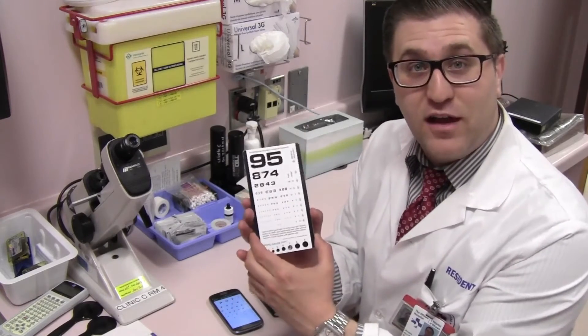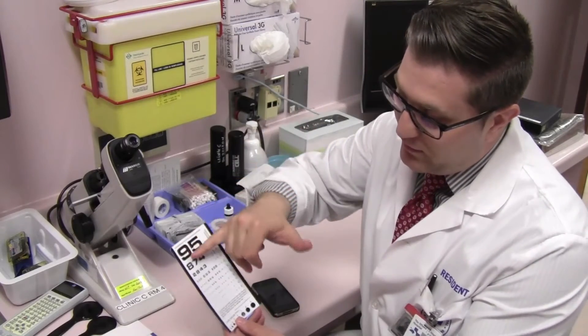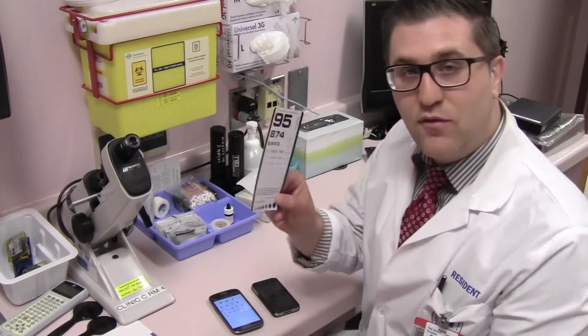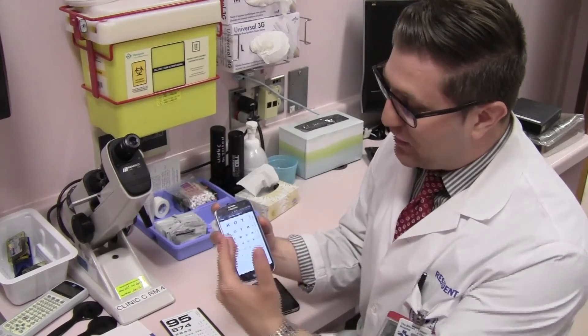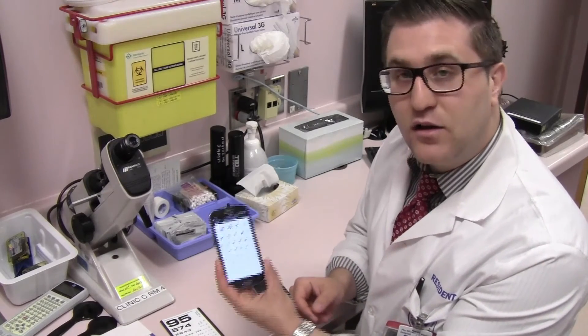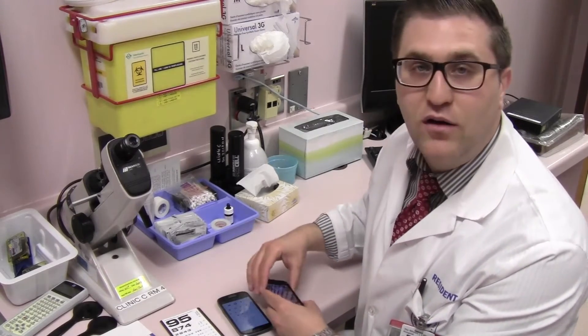Now, let's say you're in a setting where you don't have a standard eye chart and want an approximation of their vision. You can use this near vision card — have the patient cover one eye and read the numbers from the top line downwards, recording what level they can read. If you don't even have a near card, there's no excuse not to test vision. Take out your mobile device — there are apps on both Android and iPhone that have an eye chart for near vision testing.